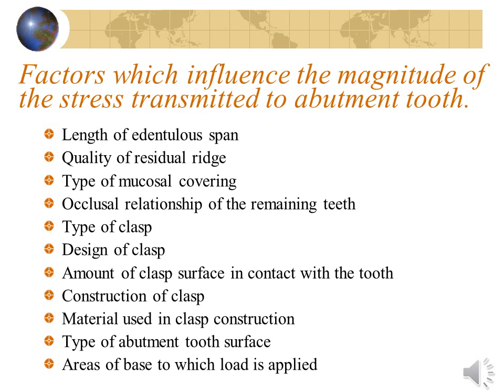Next is the areas of the base to which load is applied. The occlusal load should be applied on the center of the denture bearing area both antero-posteriorly and buccolingually.